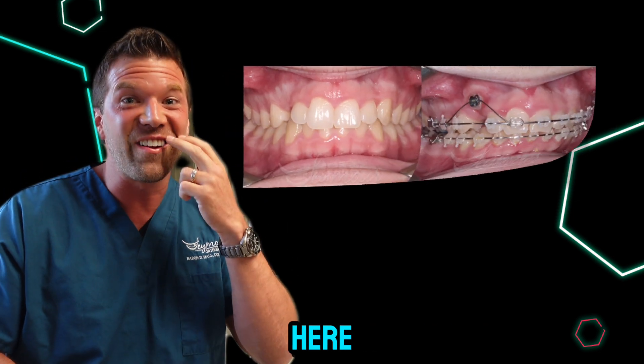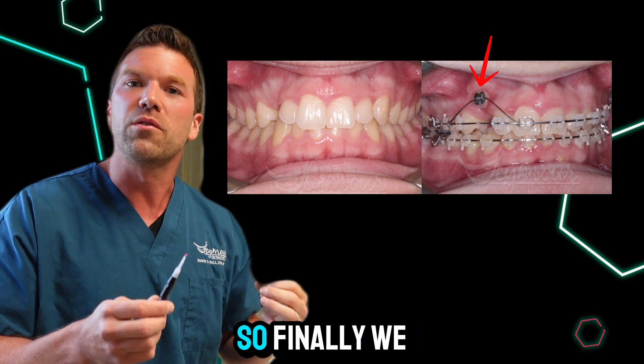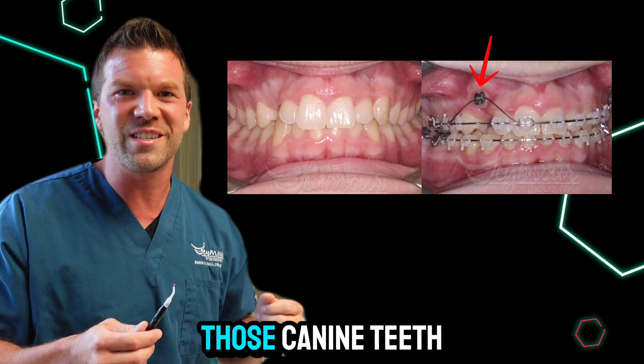Another application right here — you can see these canines are sitting too high up. We waited months for those teeth to come in, so finally we ended up using a soft tissue laser to remove a little bit of gum tissue right there so that we could put braces on those canine teeth.